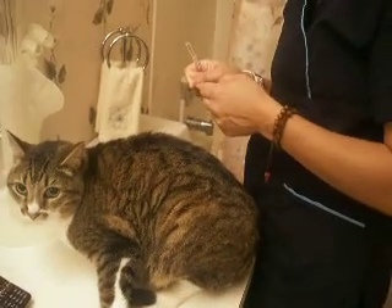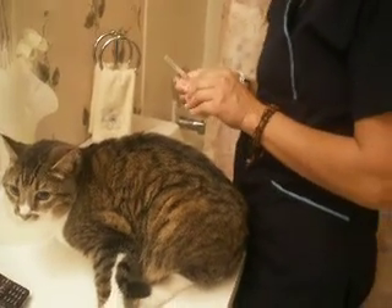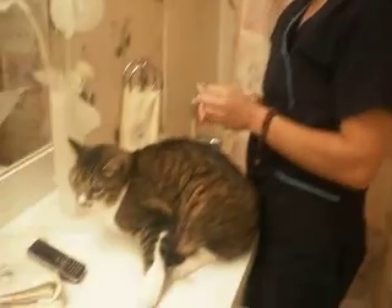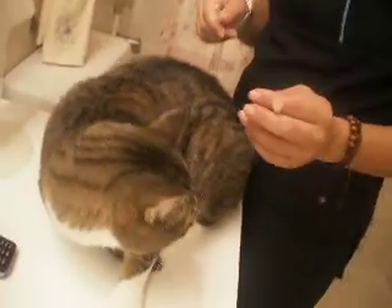We're here to show you how to give subcutaneous fluids for a kitty cat, and it's the same if it's a dog — the same thing — it's just that this patient is smaller than a dog.